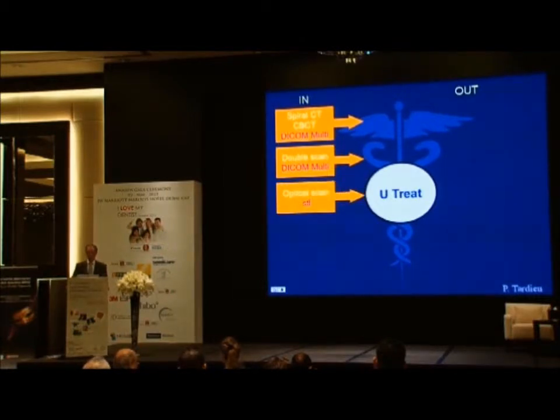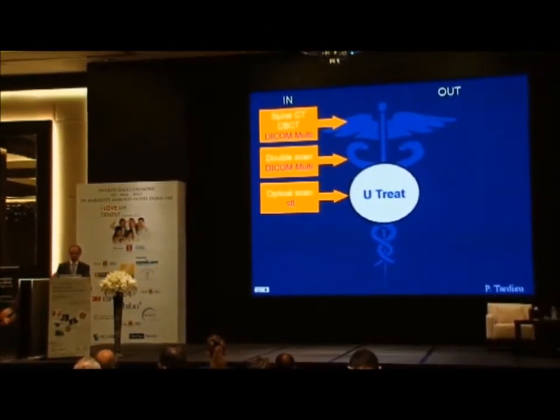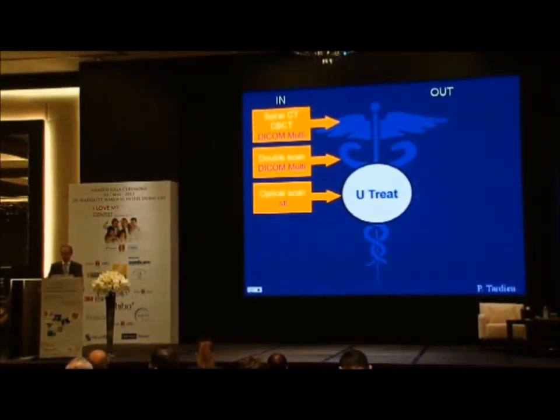We can work with optical scan. An optical scan is when you want to increase the quality of the support of your surgical guide, you need to get a good image. This image is coming from a plaster cast, coming from an impression of your patient's jaw, and this is scanned with an optical scanner. You have several optical scanners here, and you will see what it is, and it's very accurate, and it's more accurate than the quality of the CT scan that you can get.